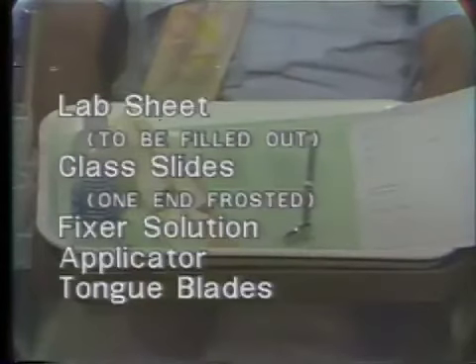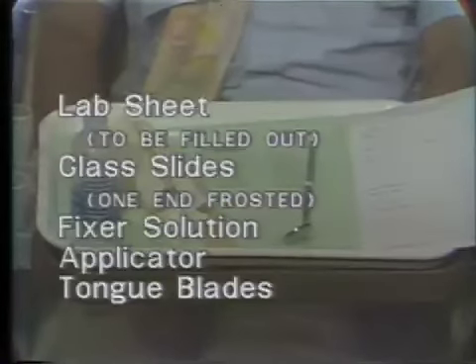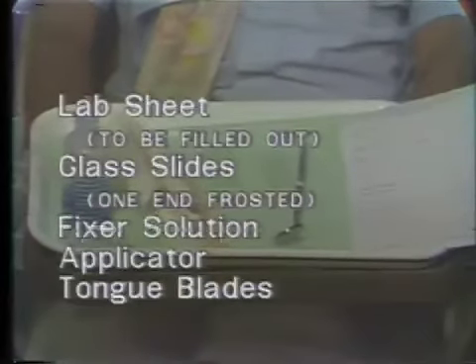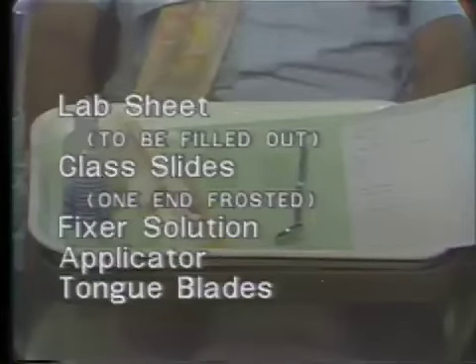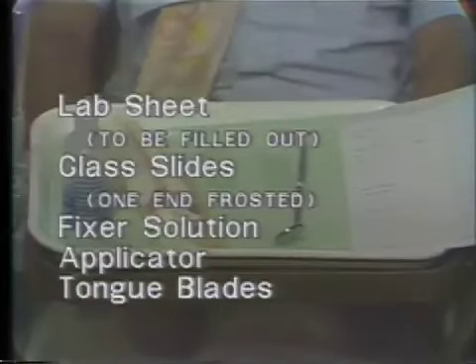A laboratory sheet that is to be sent with the specimen to the pathology laboratory should be made out in some detail. It should include, of course, the patient's name and the date and identification number. Also, some of the characteristics of the lesion, such as the length of time that it's been present, the site from which it came, and something about its clinical appearance. Glass slides are needed on which the specimen can be smeared, one end to be frosted so that the patient's name and the date and identification number can be recorded there.